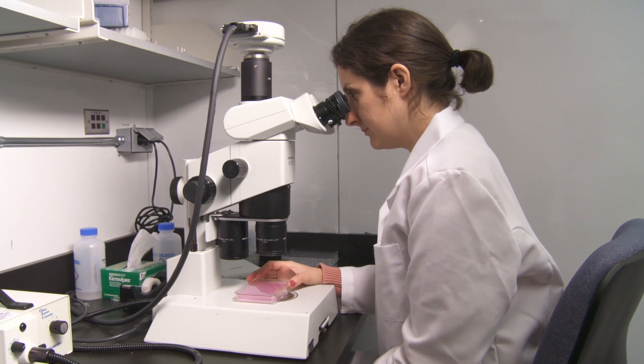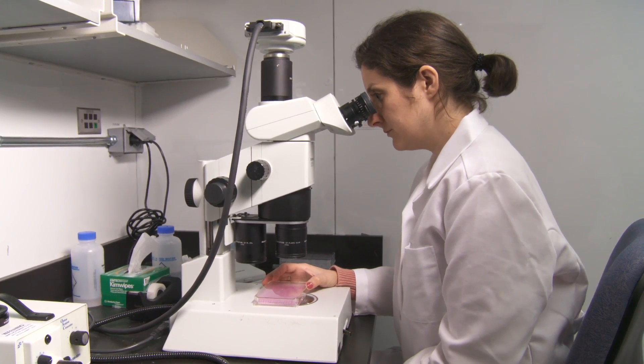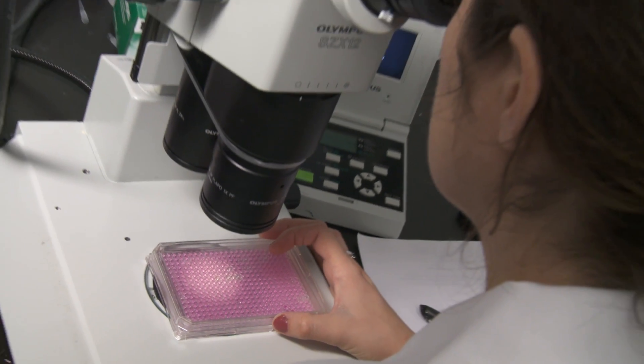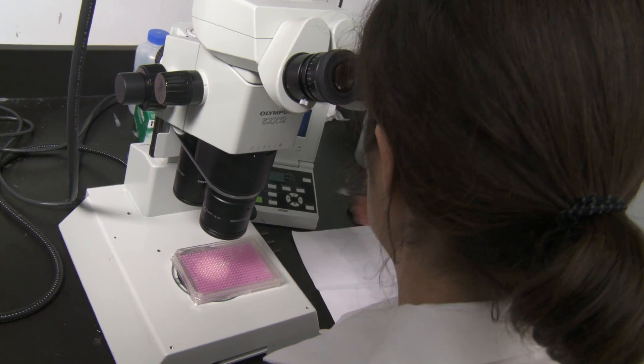It takes about 10 to 15 years to get a drug to market for a pharmaceutical company, and it costs up to two billion dollars. Our goal is to allow researchers to form spheroids that mimic the human body much earlier in the process. When they do this, they'll get more accurate data earlier, and we believe that millions and millions of dollars can be saved on that drug's path to market.